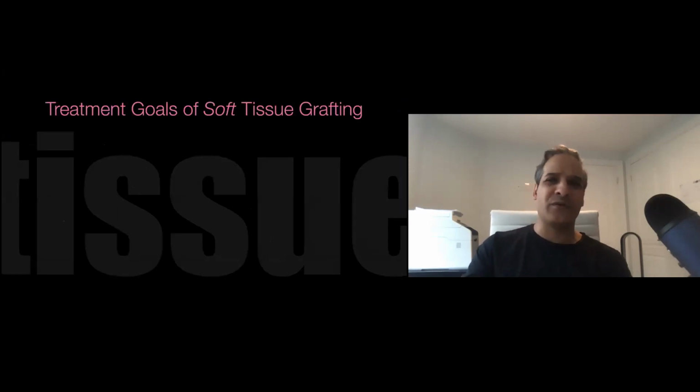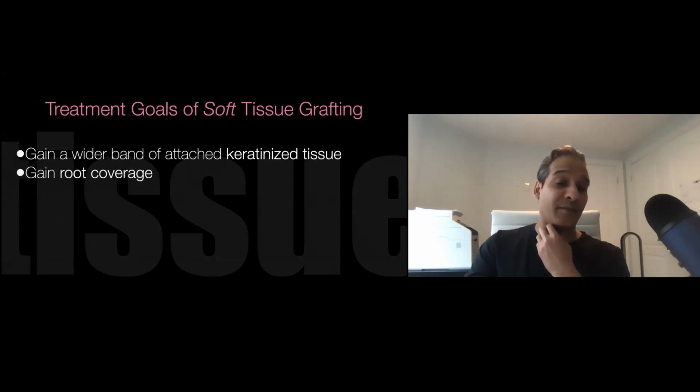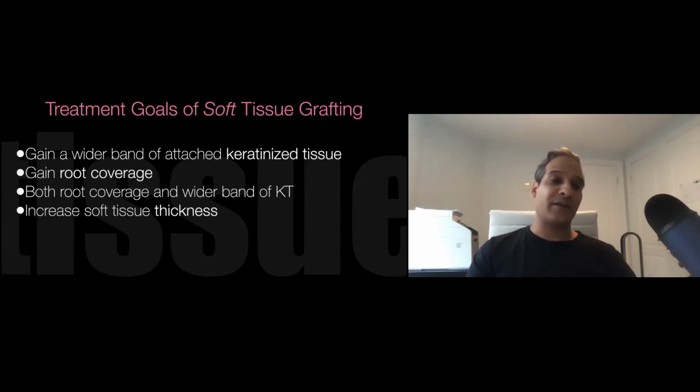So what are the goals of soft tissue grafting? What do I try to do? What is my intention? So depending on the case, number one is, from a health point, we want to gain a wider band of attached keratinized tissue. You want to gain root coverage in some cases, if it's an aesthetic thing. We want to sometimes get a little bit of both. Sometimes it's no attachment and recession, and you want to get that band of tissue as well as gain the root coverage to make it look nicer.